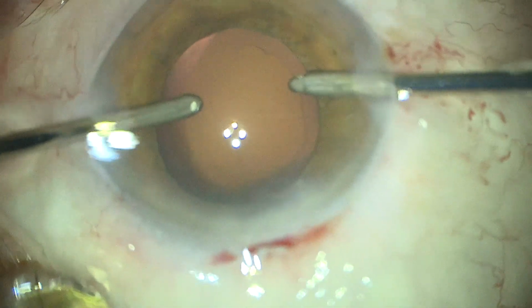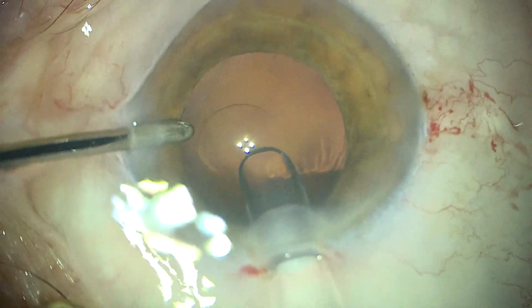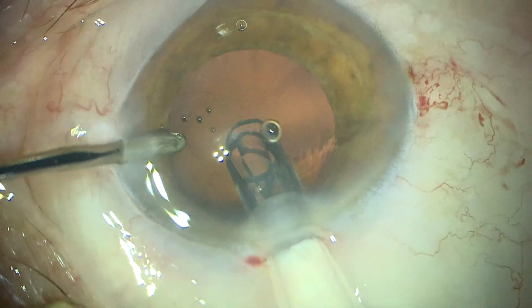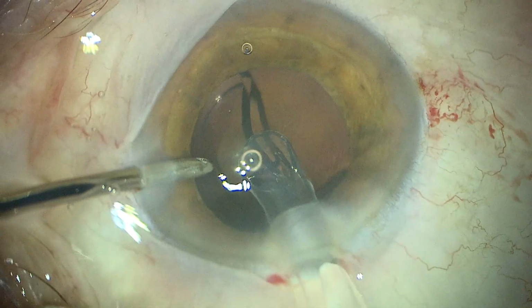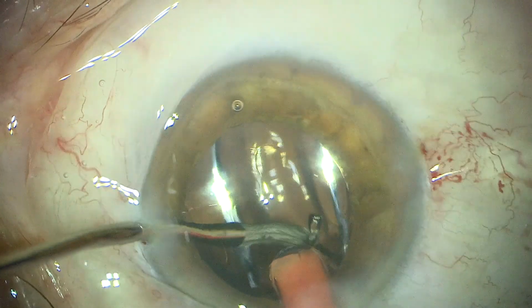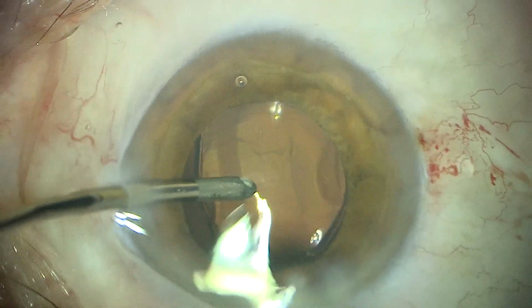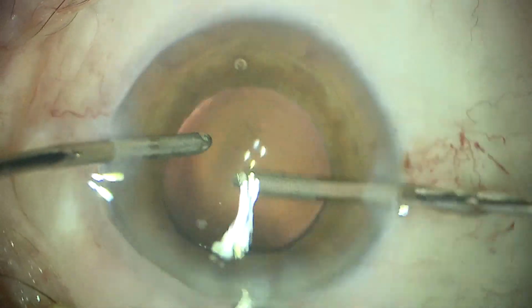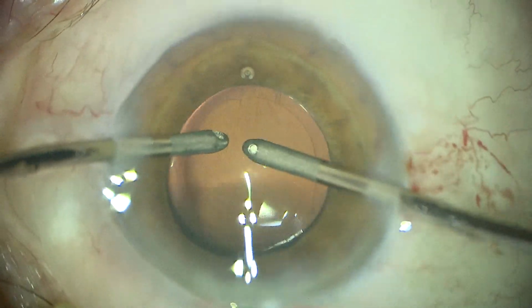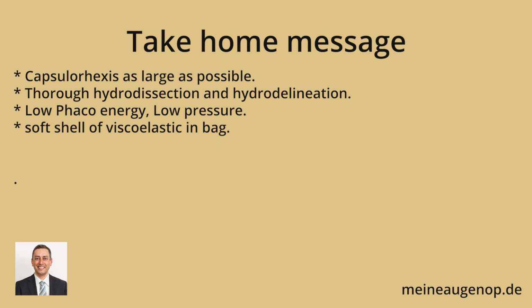When we wish to implant the lens, it is safer to implant the lens under viscoelastic, but in this case we implant underwater. The only viscoelastic we see here is from the injector itself, but it can still be done easily. We implant the lens and we let the haptics expand centrifugally. We do not rotate the lens in this case. We do not push on the capsule. We can only push on the center of the optic to allow residual viscoelastic to float forwards.